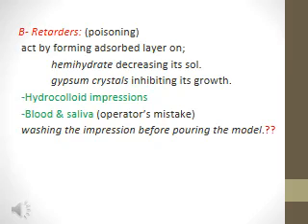Of course, it is not a manufacturer's mistake, it is an operator's mistake. When you take an impression from your patient, you have to wash it. After taking the impression, you have to wash it with water thoroughly, and then disinfect the impression before delivering it to the technician to pour it with model material.